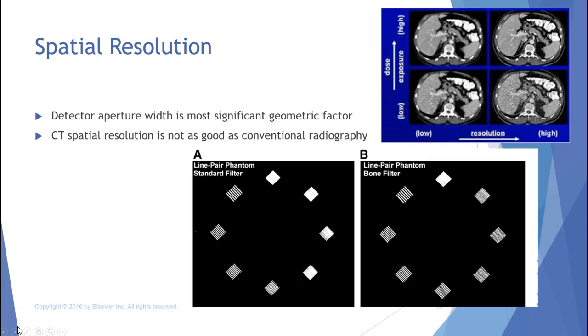And the bottom two square objects here are what the CT phantom looks like. So this is one picture that you would get when you do CT QC. And what you do is you count how many line pairs that you actually see in each of the squares, and the ones that you can make out best. And that shows what your spatial resolution is for that.